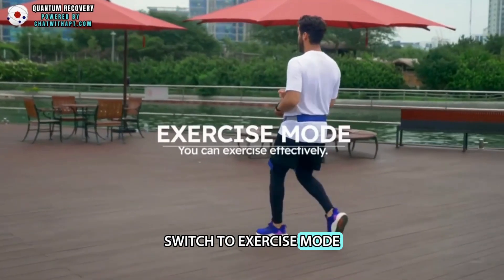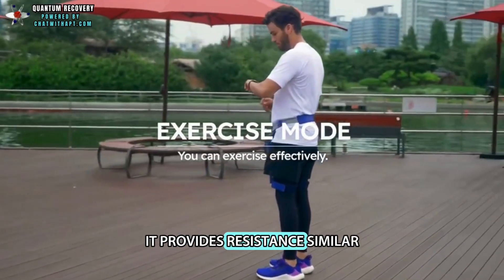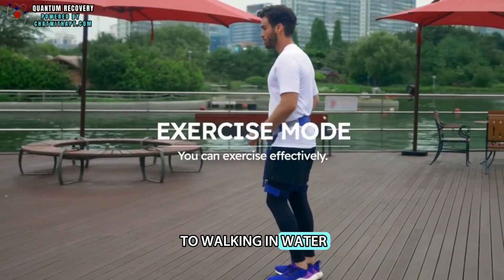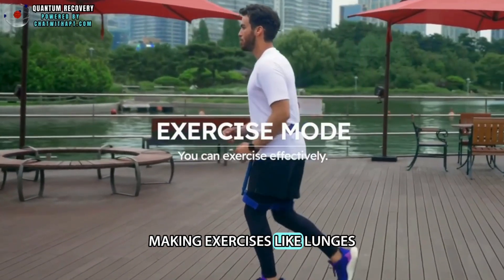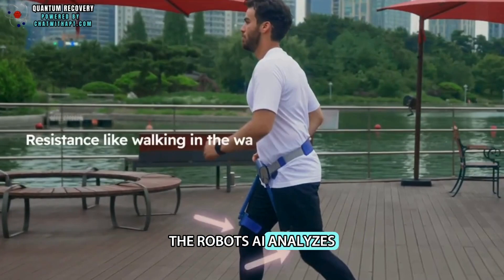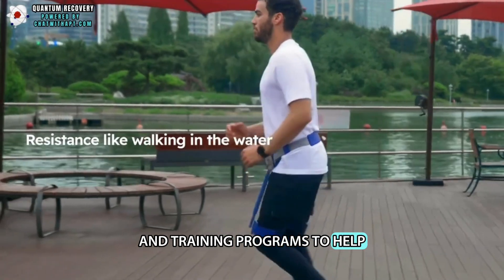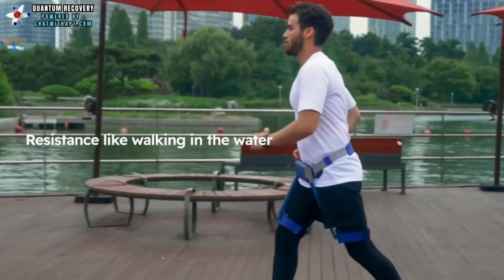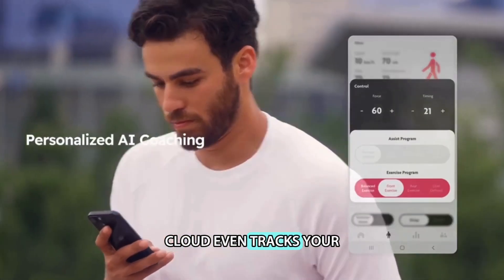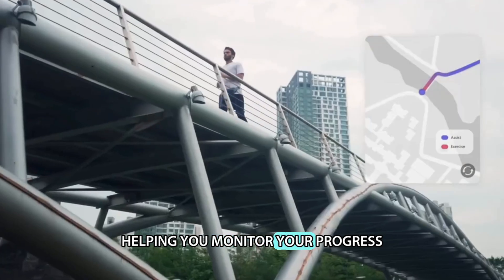Switch to exercise mode, and WIM becomes your workout partner. It provides resistance similar to walking in water, making exercises like lunges more effective. The robot's AI analyzes your walk, giving personalized feedback and training programs to help you reach your fitness goals. The AI cloud even tracks your long-term muscle and joint data, helping you monitor your progress.